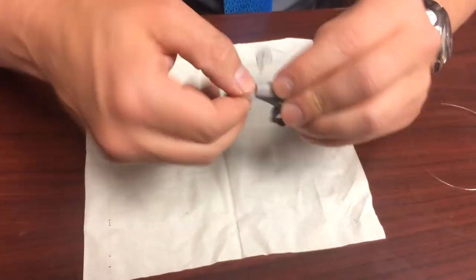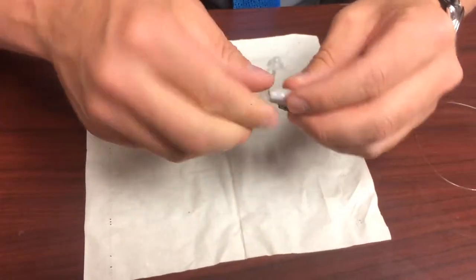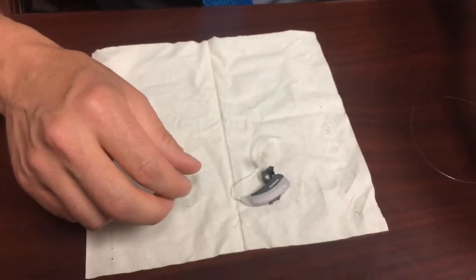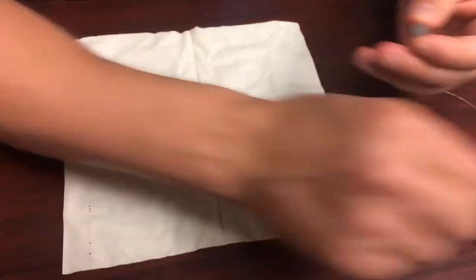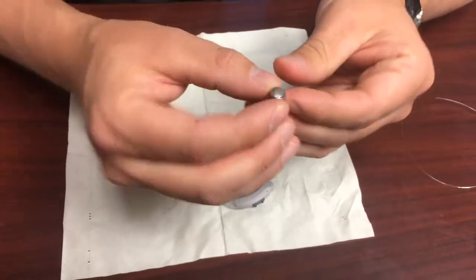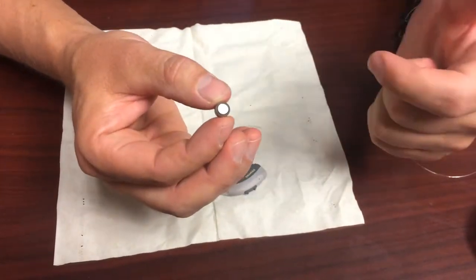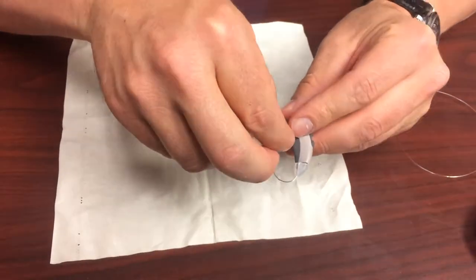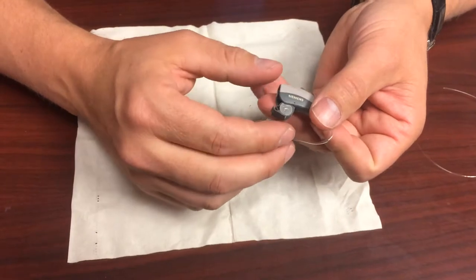This just screws back on and now we're ready to put in the battery. The battery comes with a sticker on it — you need to peel that off. You'll notice it's got a plus on it on the positive side, and on the negative side it's got nothing, just a little bevel. When you put this in the battery door, the negative side will go down and you should be able to see the positive markings on there.